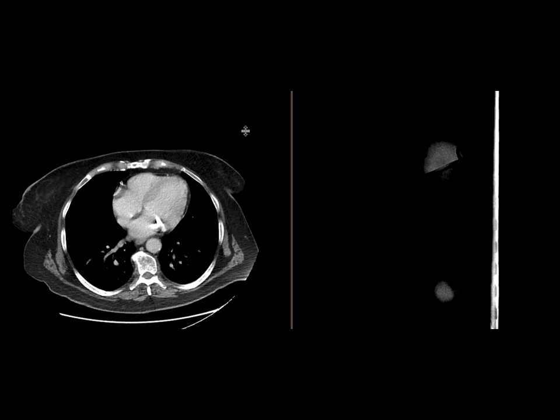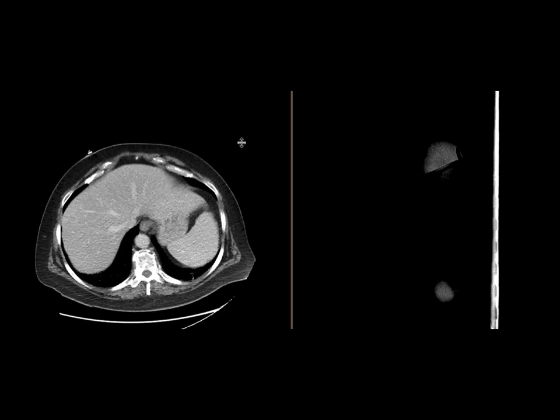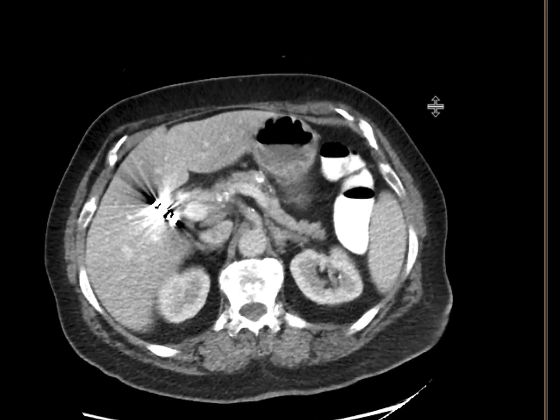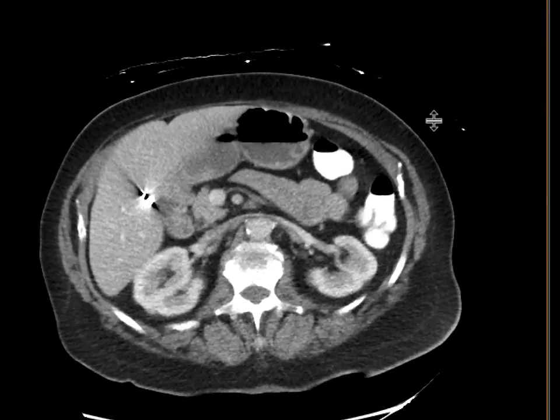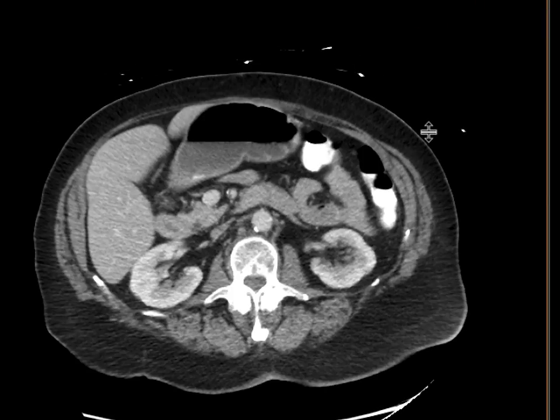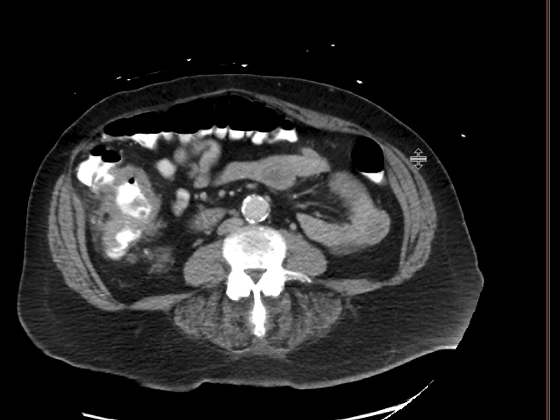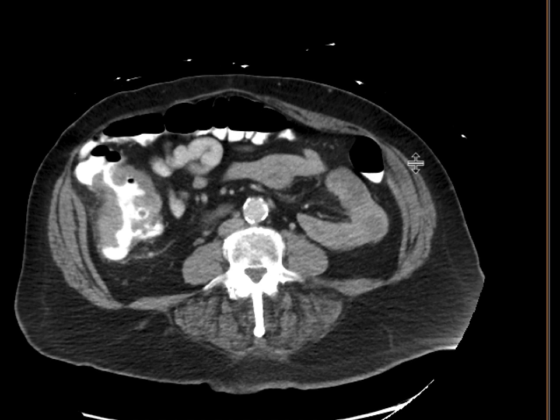This patient had come in with abdominal pain and some bloody stools, and they got a CT scan with intravenous contrast and oral contrast. As we scroll down, we can see that right about here in the ascending colon there is this very focal region of wall thickening.